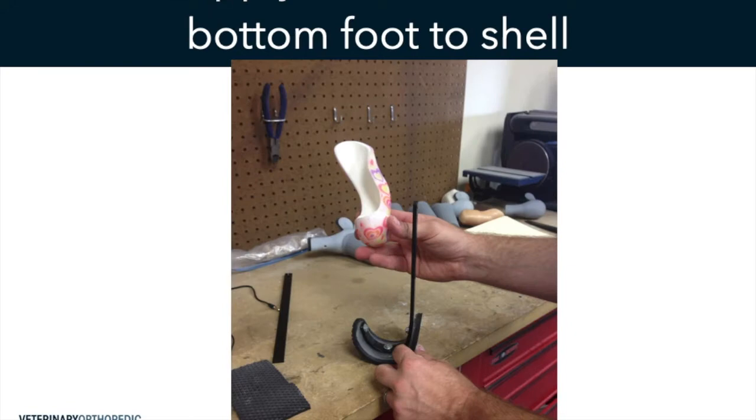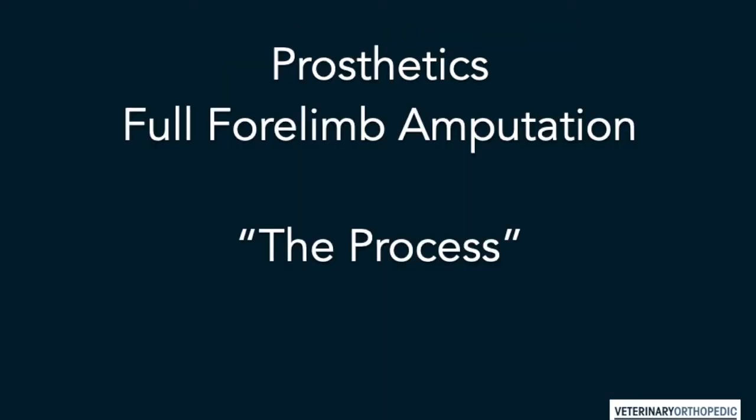So then you apply the shank and the rocker bottom foot to the shell. Okay, so you can see the little foot portion at the bottom. There is what we call the shank area. It's a metal bar basically, and it's then going to attach to the actual plastic mold. And then that's sent back and applied to the patient.